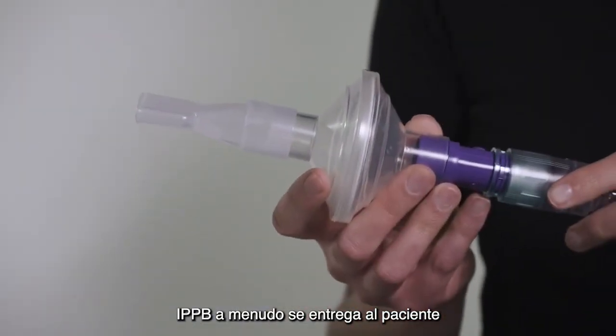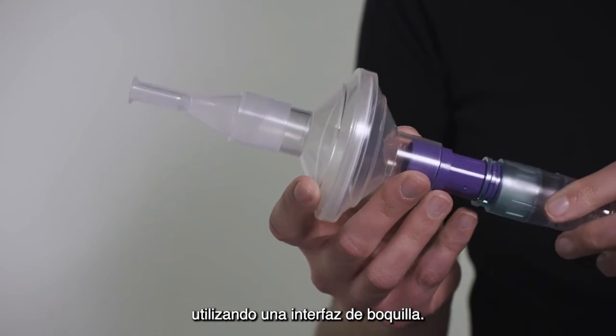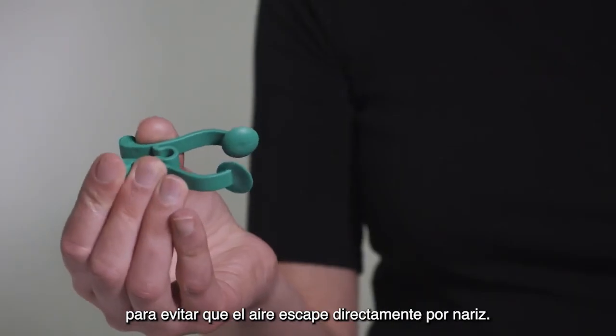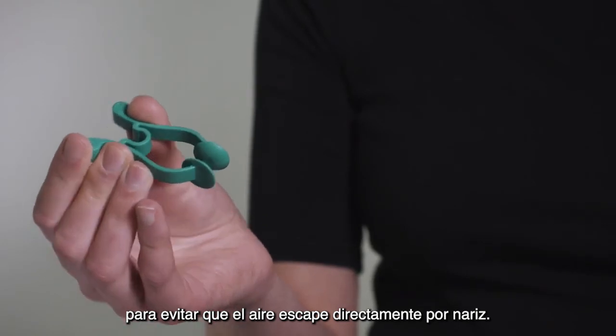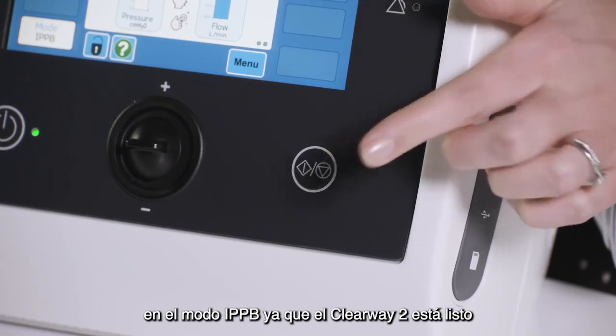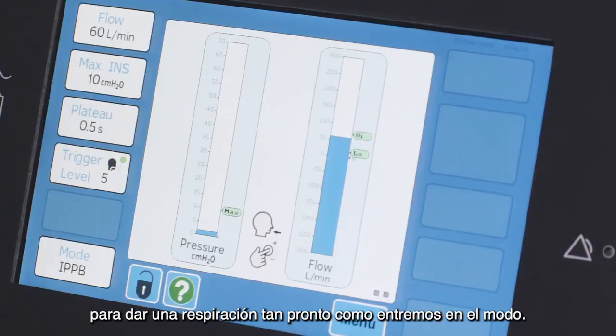IPPB is often delivered to a patient using a mouthpiece interface. A nasal clip can also be used if required to prevent air escaping directly from the nose. There is no need to press the start/stop button in IPPB mode, as the Clearway 2 is ready to deliver a breath as soon as you enter the mode.